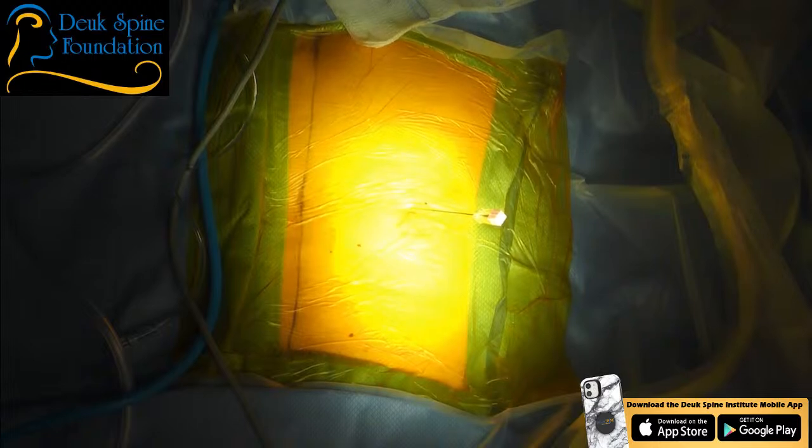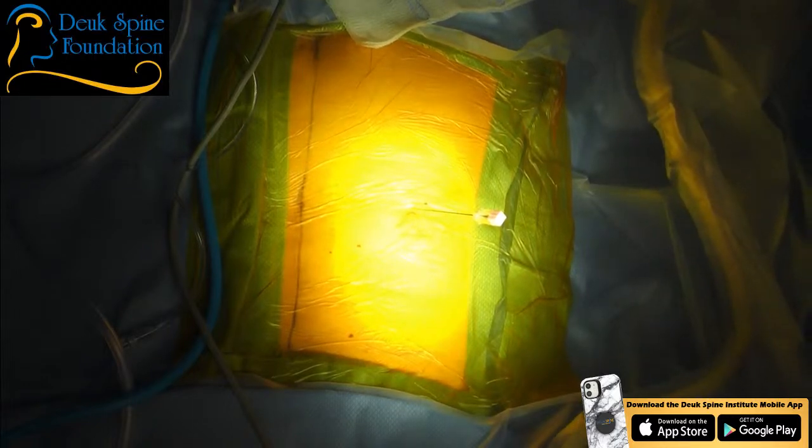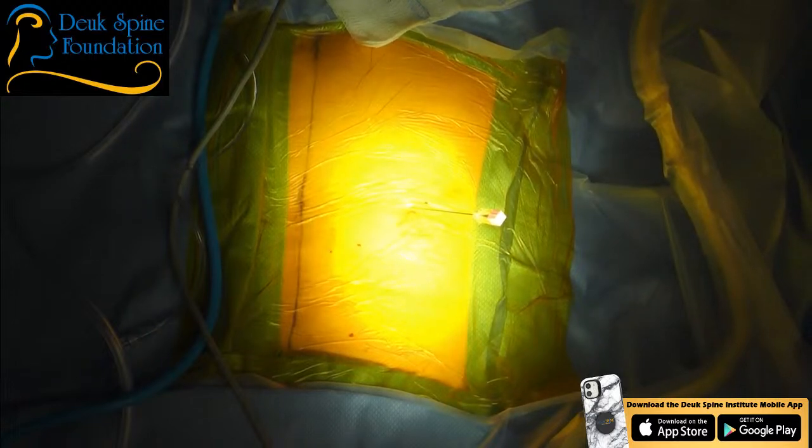I still think we got a wag issue. And we still have a rotational issue. Look at the S1 pedicles, they're offset. So we need to rotate and we need to wag a little bit. Let's start with the rotation. It's the other way, I think.